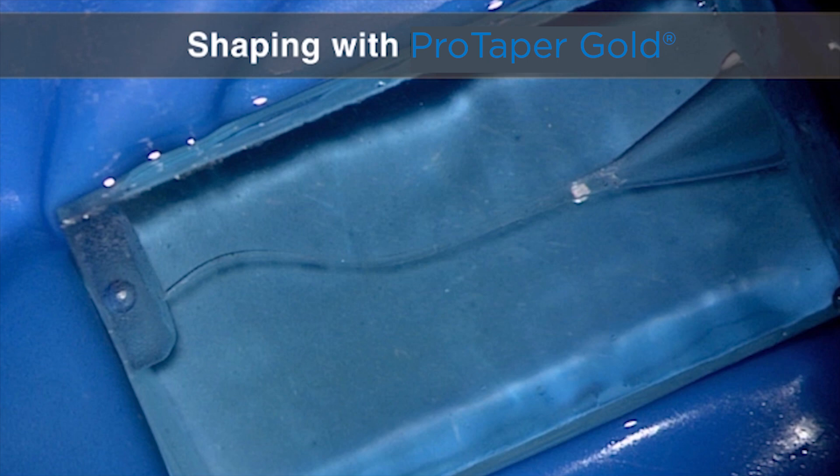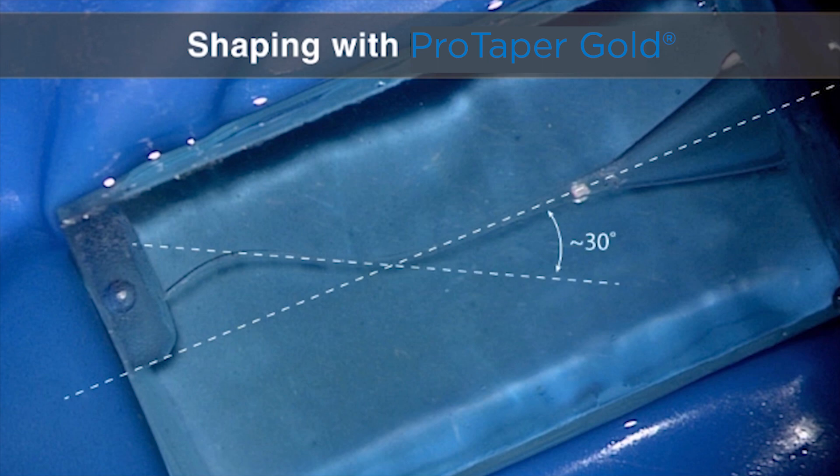Plastic is harder than dentin to work in. Plastic is soft, so because it's a little softer than the Brunel hardness of dentin, it's much easier to ledge or block a canal. So we're going to have to put all the steps together very precisely and follow them exactly so that we can guide this canal shaping procedure to a successful conclusion. If we draw a tangential line to the first curve relative to the straightaway portion of the canal, you can see it forms an angle of about 30 degrees. And if we draw a tangential line to the second curve relative to the first curve, you can see that's about 35 degrees of recurvature. So it's a good little challenge.